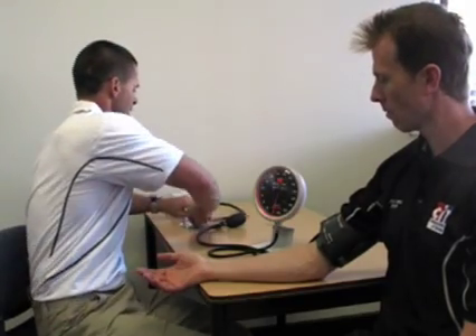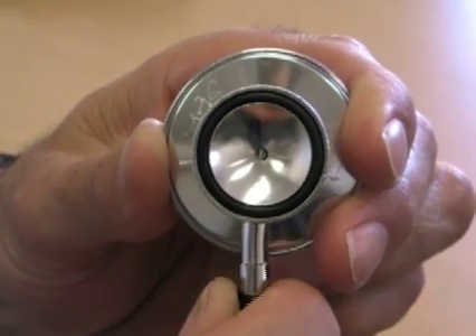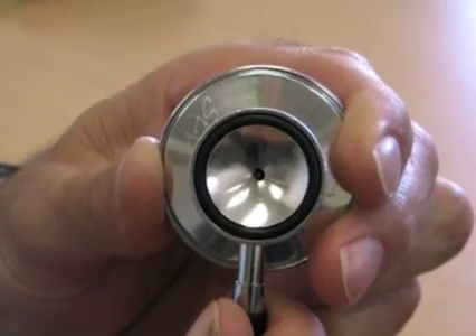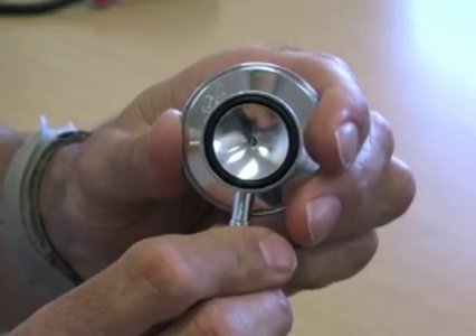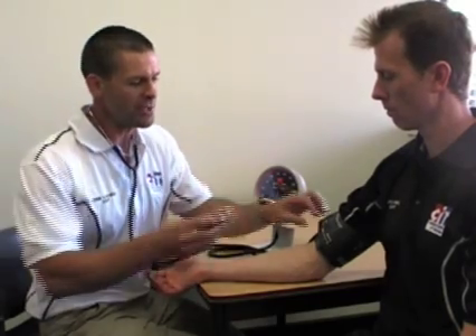Once the cuff is on, grab the stethoscope. Most stethoscopes have a valve. When the valve is open, sound waves pass out through it. When you lock it, sound waves reverberate so you can hear them through the earpieces. Make sure the valve is locked and closed so you can use it properly. Before testing, put the stethoscope around your neck, position the chest piece onto the arm using your thumb to hold it in place, then put the earpieces into your ears.